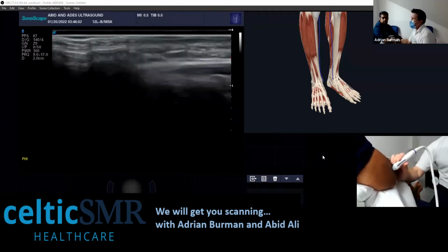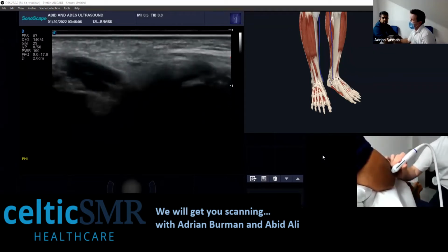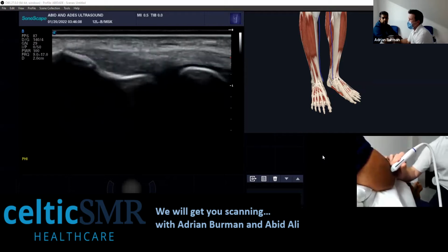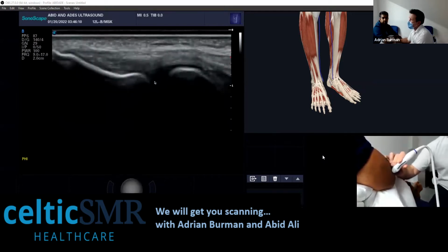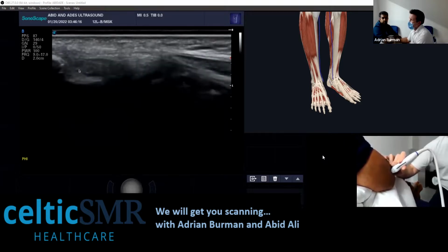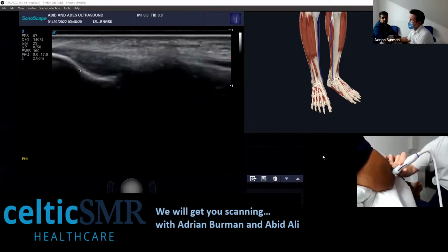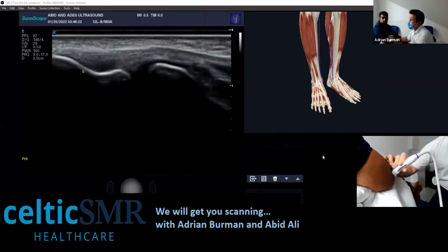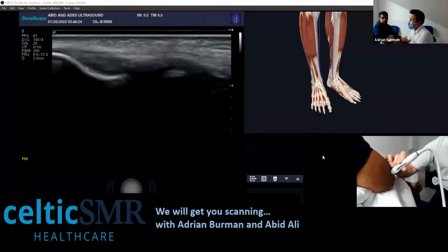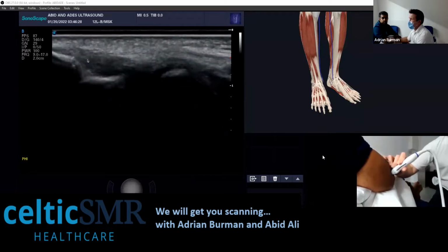It's quite difficult to do it as a percentage because there's no clearly defined area. Some of this will be collateral ligament, so depending on what you see and how much is ligament and how much is tendon, it's quite difficult to interpret. So I would probably just tend to measure it.